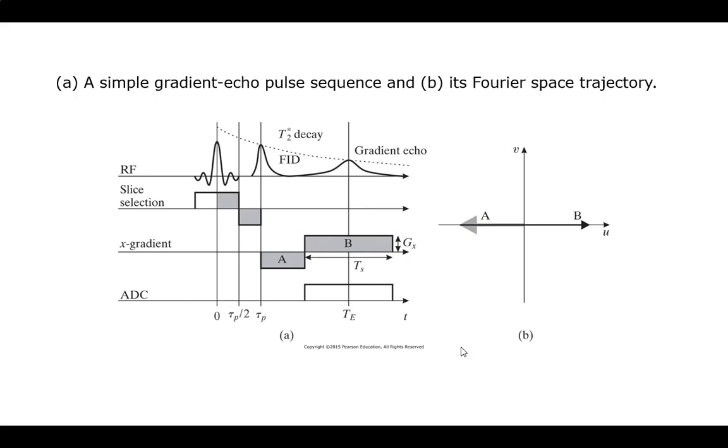All right, so let's step it up. What if I wanted to read the whole line? That means I have to push myself back to the extent of where I can do measurement and then read the whole thing. That's why this is going to be half of that.